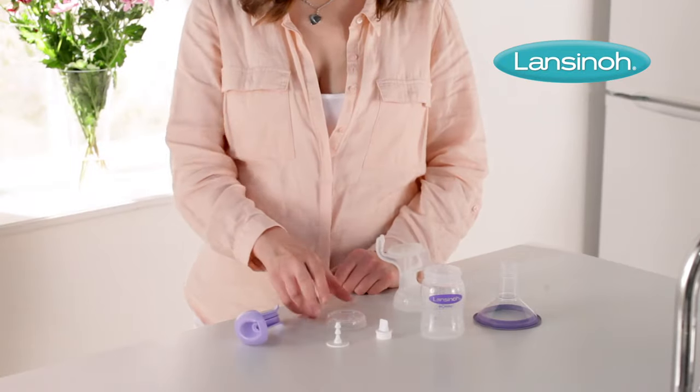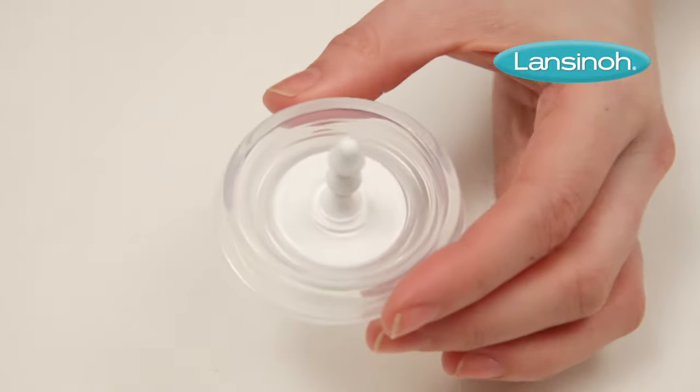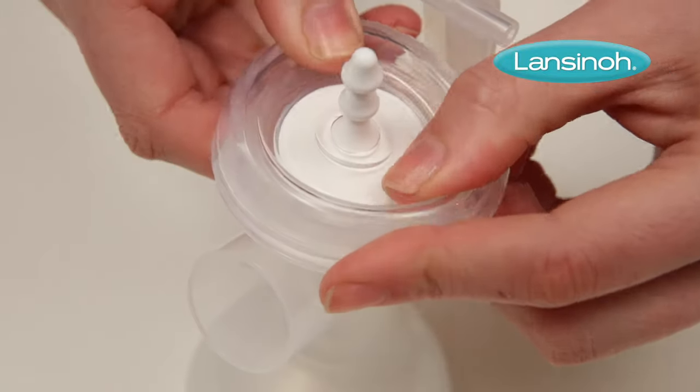The first step is to insert the stem into the silicone diaphragm, then place these onto the pump body. Make sure it fits securely around the rim by pressing down gently with your fingers.